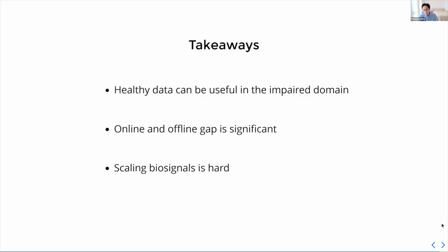And also, given that it's a wearable device, is it runnable on a microcontroller chip or on some edge devices, for example? So in our case, our model can actually only be run on a GPU. So we need to do some form of distillation or other tricks to make it actually run on the device itself.